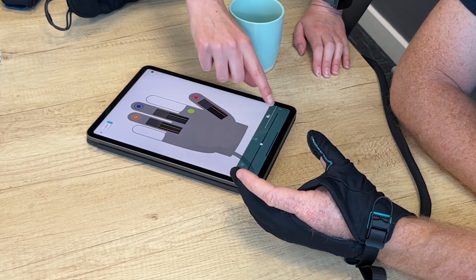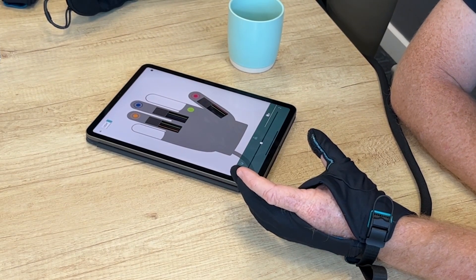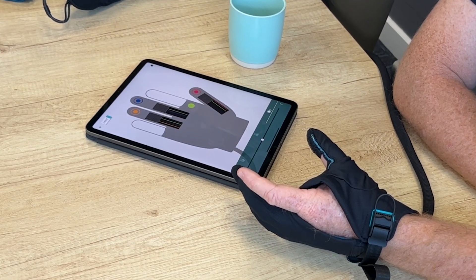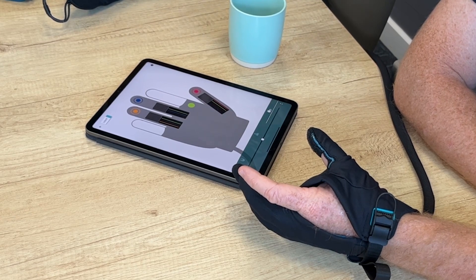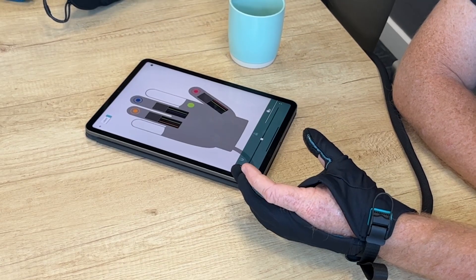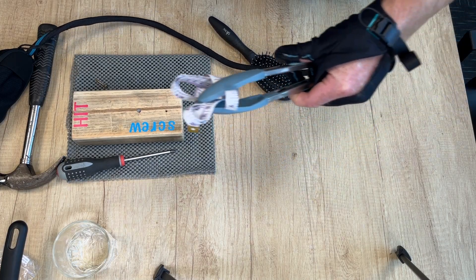The third setting, represented by a sellotape icon, is stickiness — how easy it is to release the grip. For something like a hammer, you don't want the grip to release too quickly as that could be dangerous, so a higher stickiness level ensures greater intention is needed to release and allows safer placement of the object.